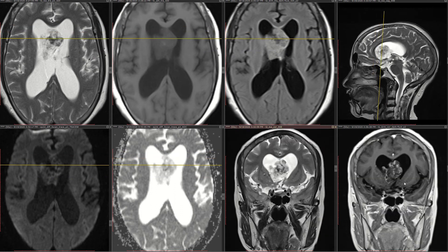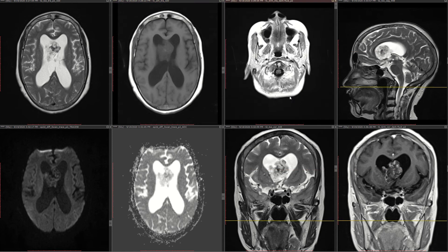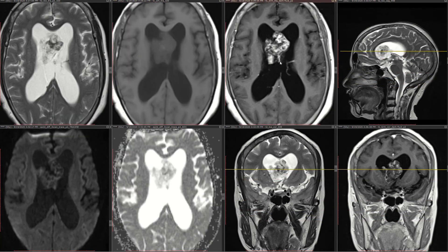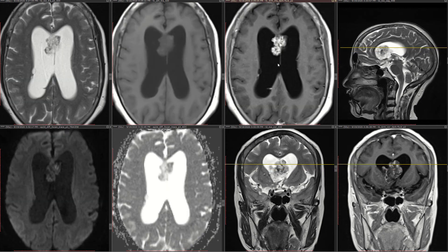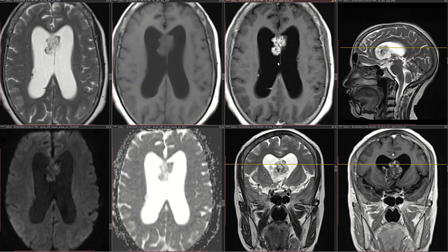There is peripheral enhancement going on. Comparing pre- and post-contrast images — and this is post-contrast — you can see the enhancement is predominantly peripheral. The appearance of this lesion is more like a fringulated or cauliflower-like morphology; it's not a regular oval shape.